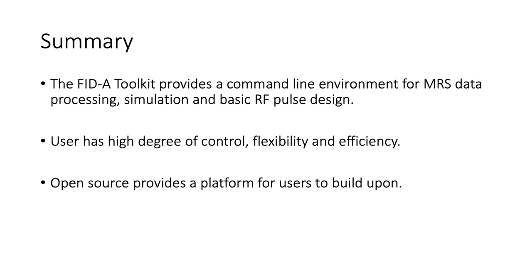So that's the end of my talk. I want to thank you for your attention. Just to summarize, the FID-A toolkit provides a command line environment for MRS data processing, simulation, and basic RF pulse design. It gives the user a high degree of control, flexibility, and efficiency. And because it's open source, it provides users with the possibility to build upon the existing tools or to change them to suit their needs.